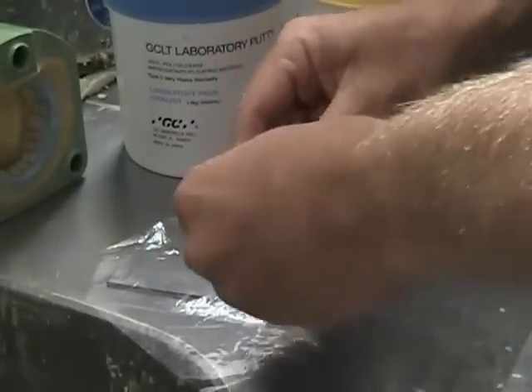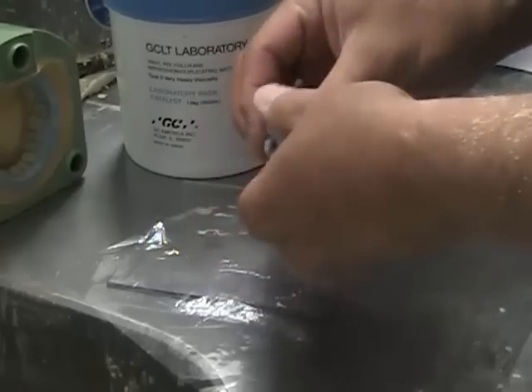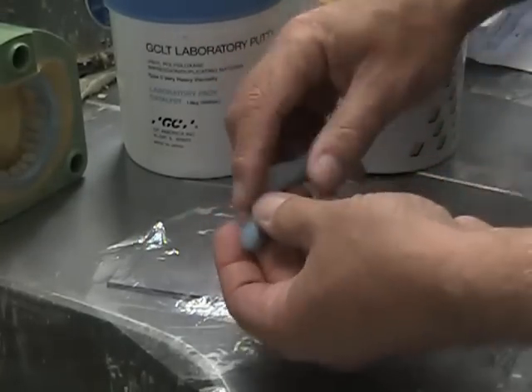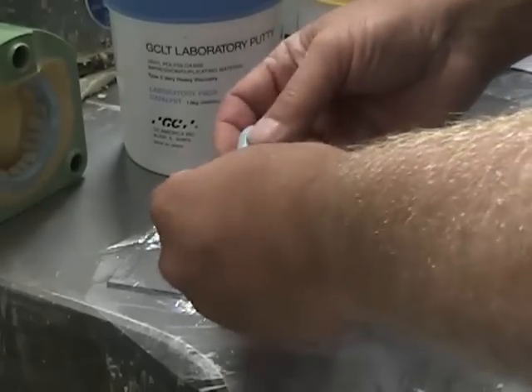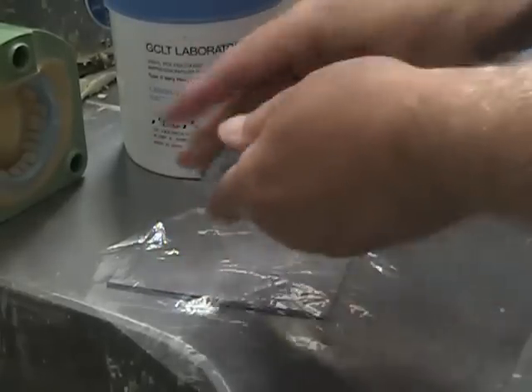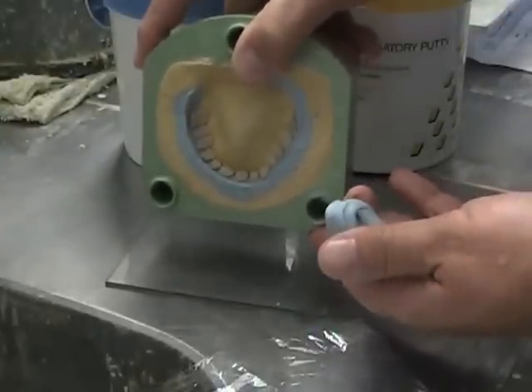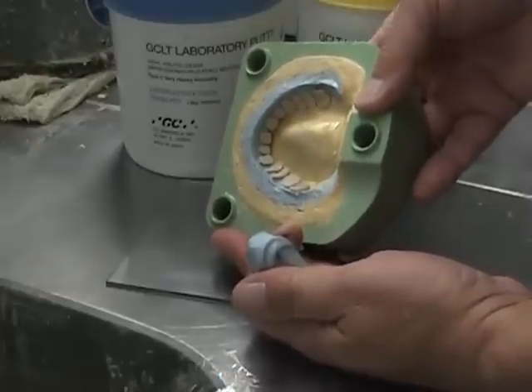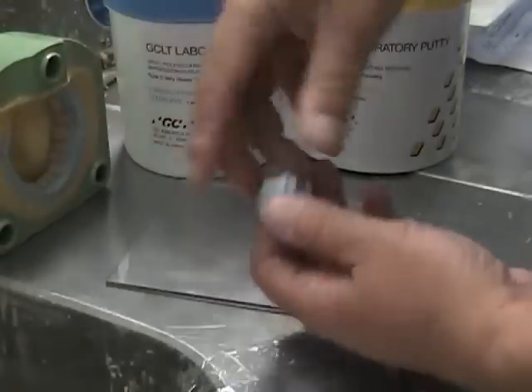Make sure you stay within the mixing time so it doesn't start setting up on you. A common problem I used to have, since I use the putty quite a bit, was once I got the putty mixed, how do I keep from having lines in it so that when I adapt it later, you can see a demarcation line. I use the putty for things like isolation barriers — one scoop of each is enough. I like it because it's a little more rigid than some other materials and it goes a long way. But I don't like to get seams on it.